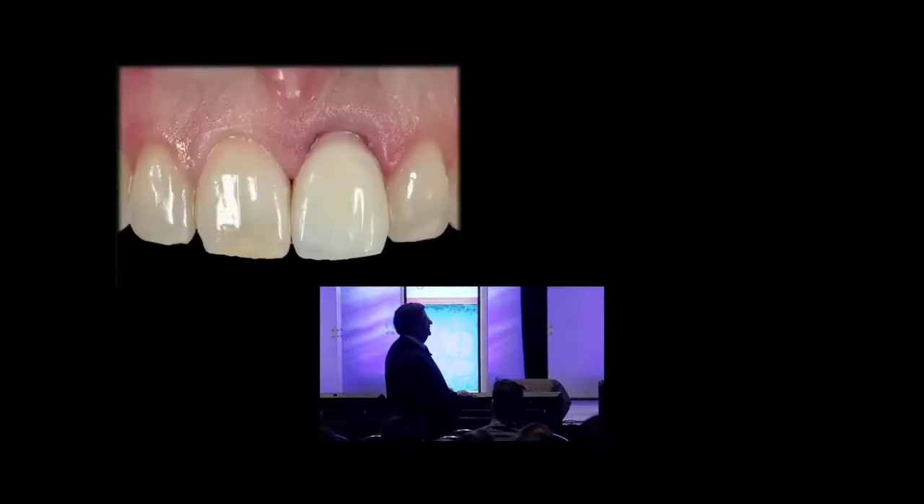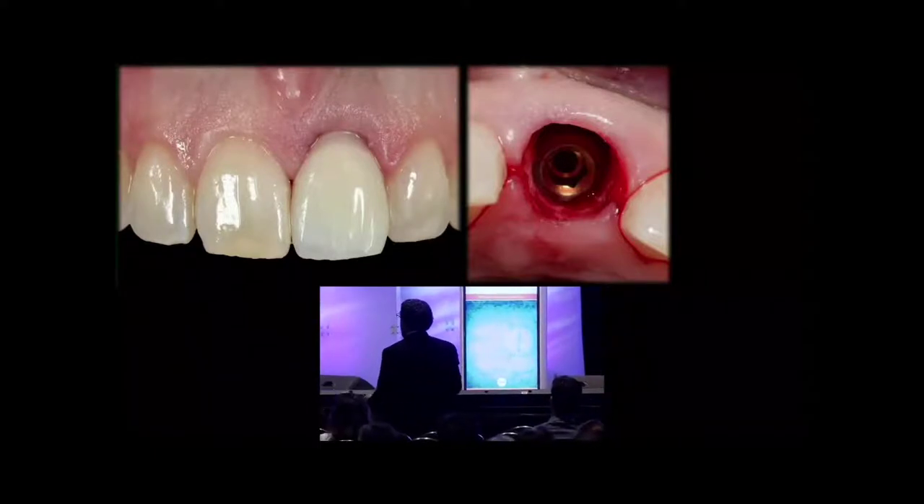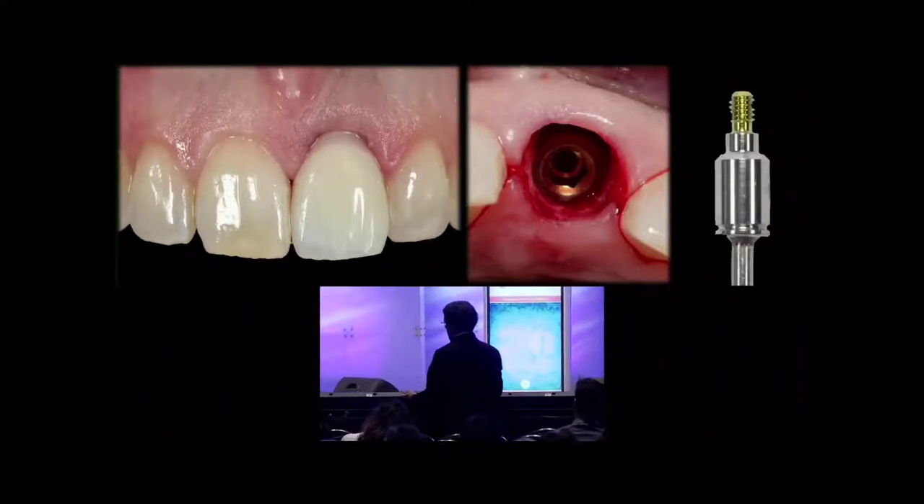Make the temporary. After the temporary is made, we take it off and take it out of occlusion. We now have a gap, as you see here, and we're going to place a straight cylinder on, whichever company you use.